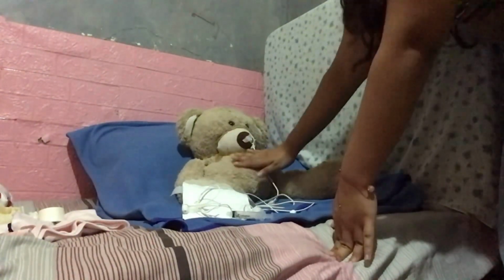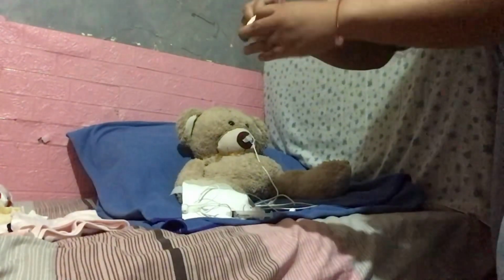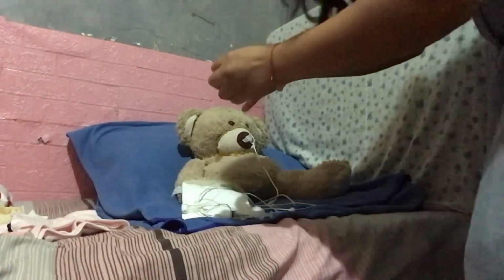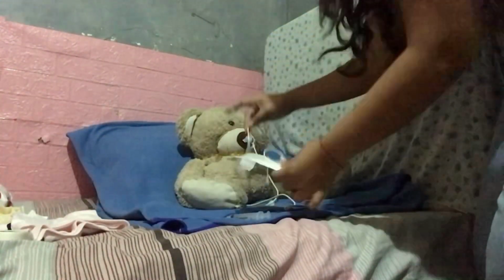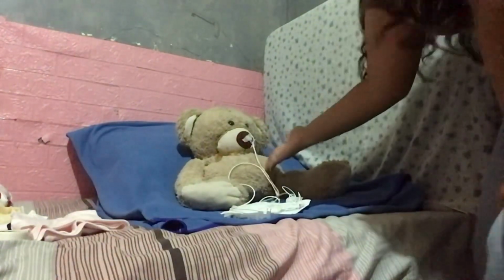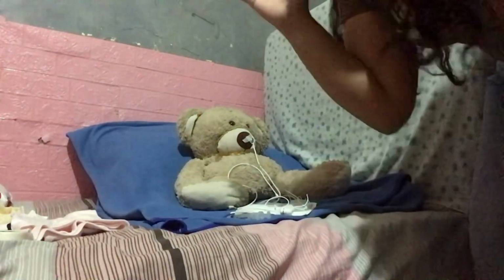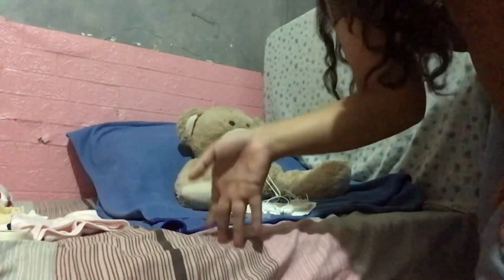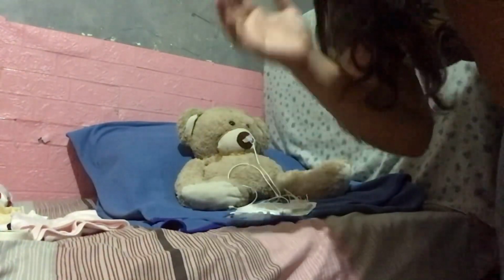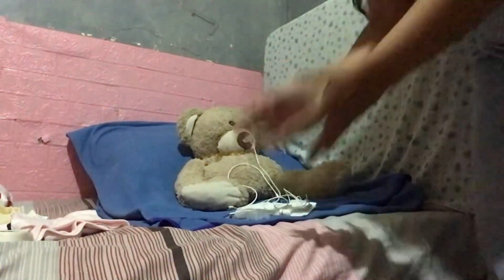or the abdomen with tape to prevent movement and tension on the urethra. So you can use a tape, and then you can secure it to the thigh of the patient here, or of course you can secure it in the abdomen part of the patient. So after that, you can dispose of all the used supplies properly, and then ensure the patient is comfortable and understands how to manage the catheter and drainage bag, and then document the procedure, including the amount and characteristics of the urine obtained. So that's all. Thank you.